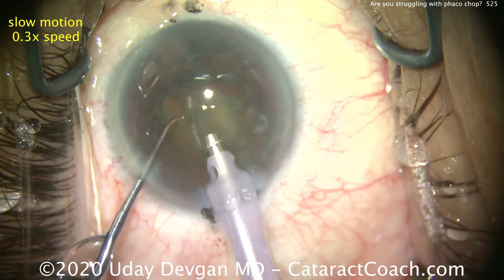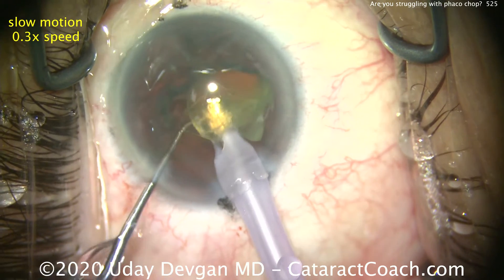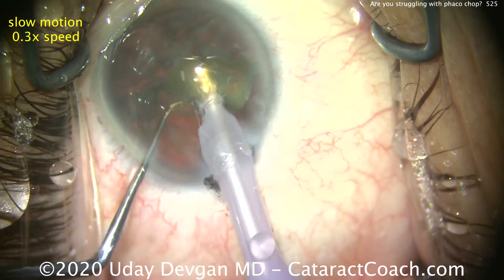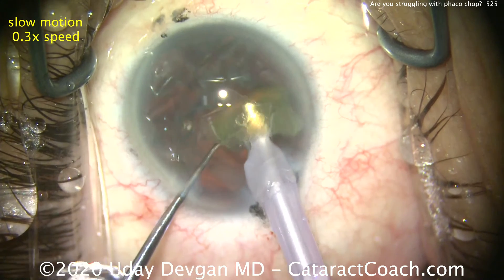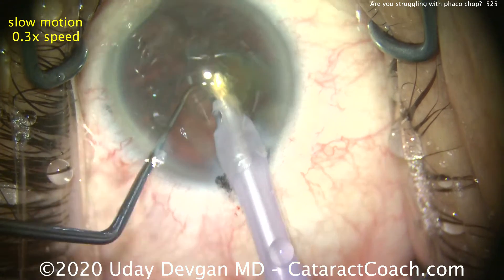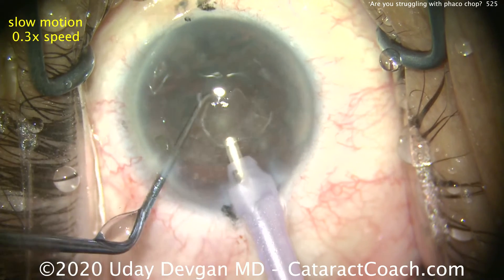Once that piece is removed, now we can go to the next little fragments. Buzz in again, bring it up. You can sub-chop or just simply keep the piece in front of the FACO probe. Notice how the chopper is just pushing the piece and keeping it right at the tip — going around, removing it, using a very minimal amount of FACO energy. This patient will have 100% clear cornea the next day after surgery, and this surgery becomes very efficient. This total nucleus removal only takes about one minute.